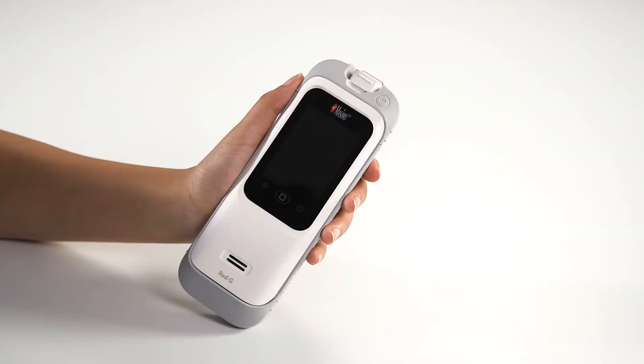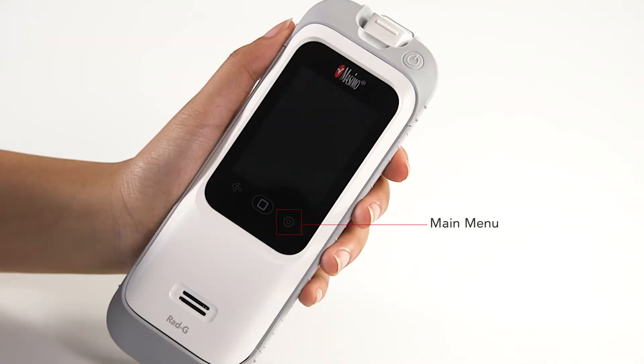The RadG controls are comprised of a color touchscreen interface, an on-off button, and main menu, home, and backward navigation buttons.